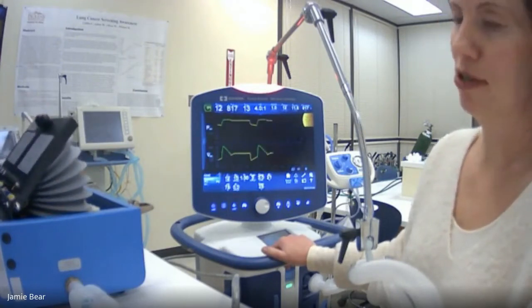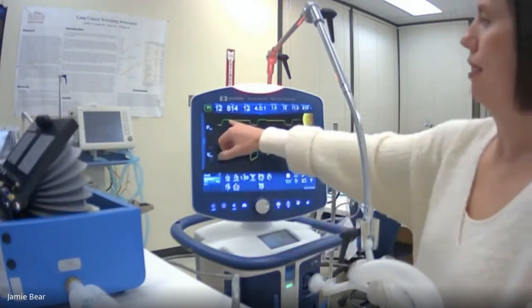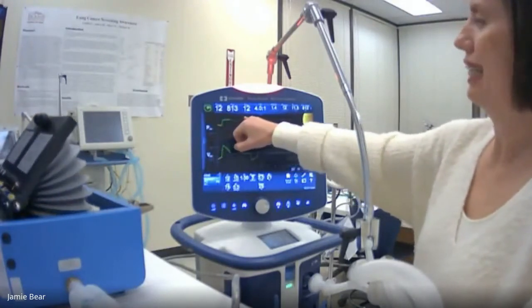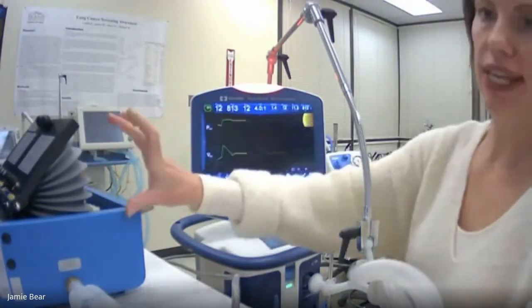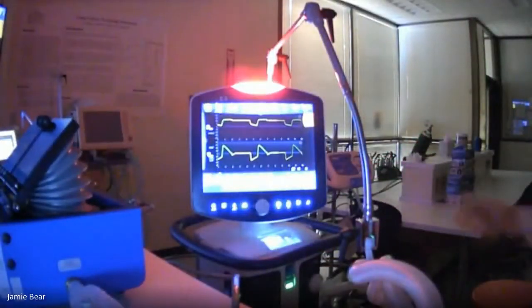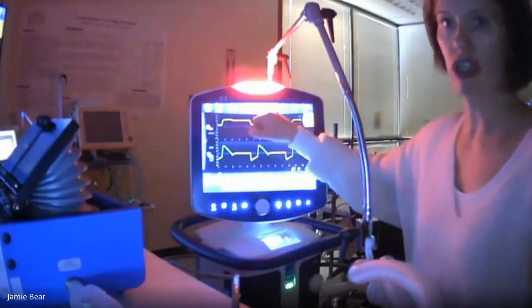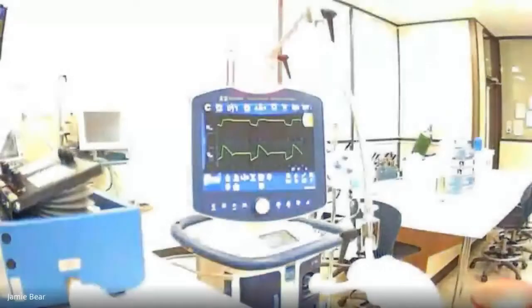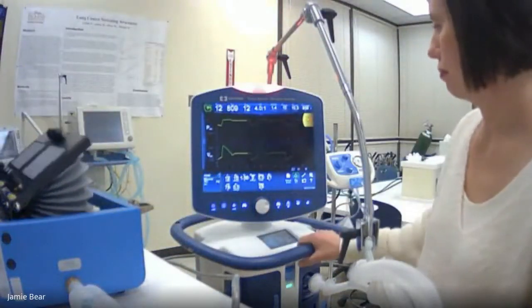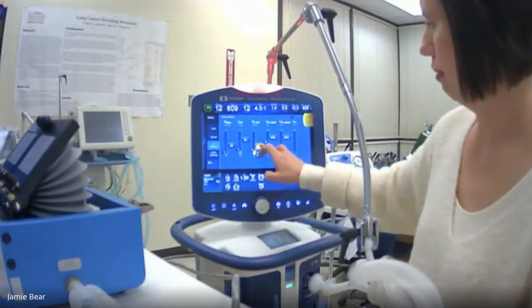Okay, now we're down 800. So if you look here, this is the point where inhalation is happening. So those lungs are just staying open. And now when the patient drops down, so we are at a 4-to-1 I to E ratio. Okay, so once again, it's saying minute ventilation, we're overly ventilating this patient.